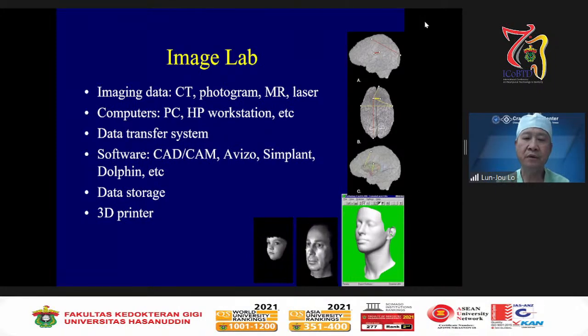What do we need now? This is the case with 3D imaging, and you can simulate and see structural deviation and the differences between A and B shown with the color map, and also use the laser imaging and the quality for the patient subjects.